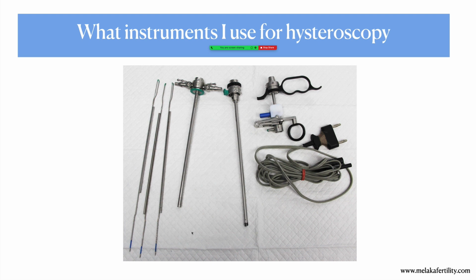I also bought this Gubbini resectoscope about 4 years ago. I rarely use it in the clinic, and sometimes I take it to the operating theatre to do it when it's under GA. But this is a 5 millimeter resectoscope that can be used in certain cases, but I rarely use it.